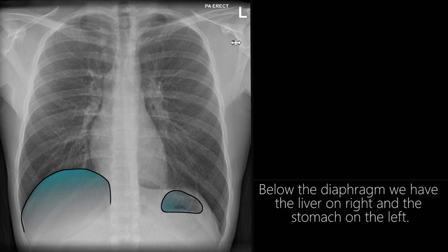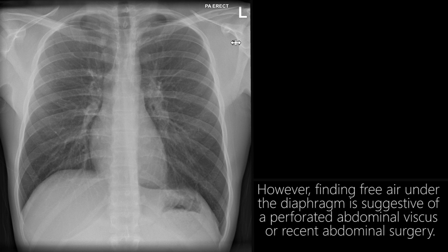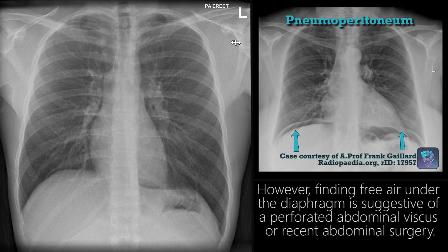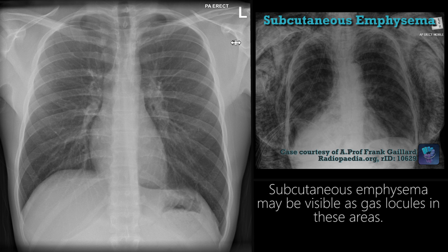Below the diaphragm we have the liver on the right and the stomach on the left. Air contained within the stomach is a normal finding. However, finding free air under the diaphragm is suggestive of a perforated abdominal viscus or recent abdominal surgery. The chest wall, breast tissue, shoulders, and lower neck can often be seen on a chest film. Subcutaneous emphysema may be visible as gas locules in these areas.